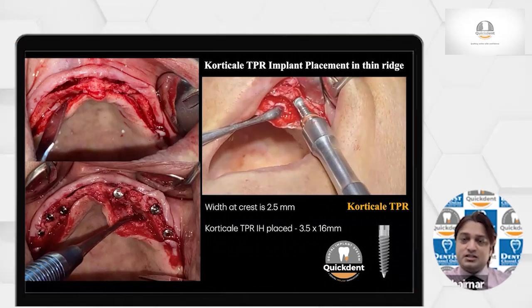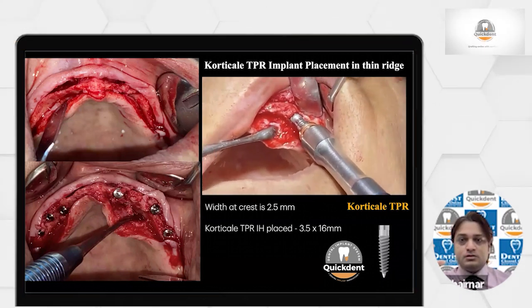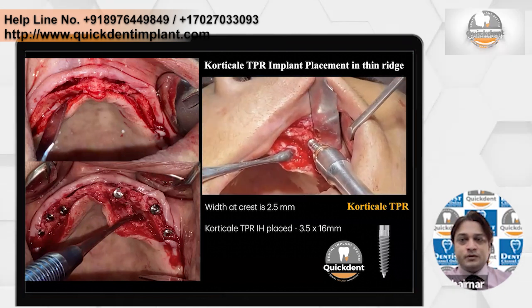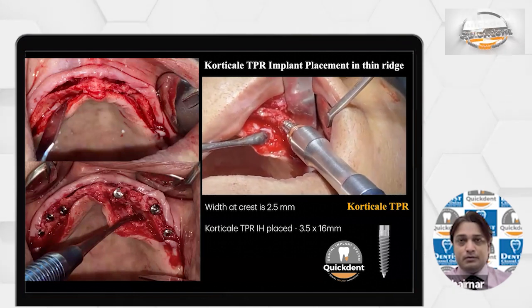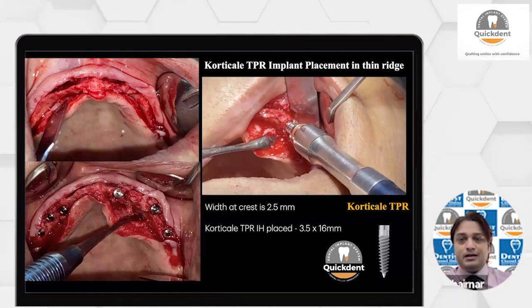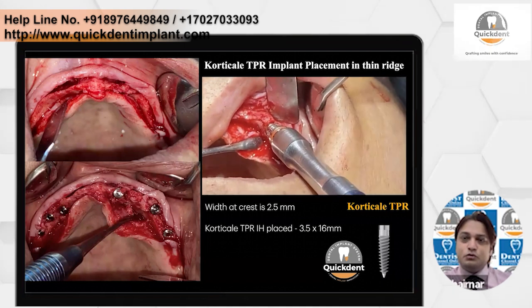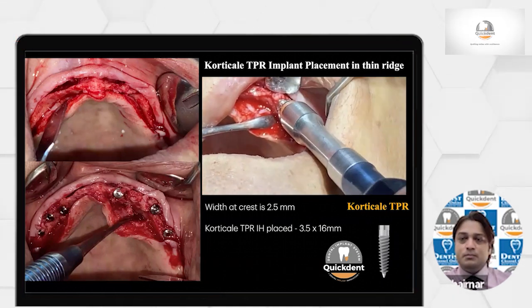If you change the direction, you may lose the torque, because in soft bone you may tend to go towards the softer wall. Between the palatal and labial walls, the labial wall is the softer one, so you tend to come out of the labial side instead of the palatal side, and I would drill towards the palatal side.